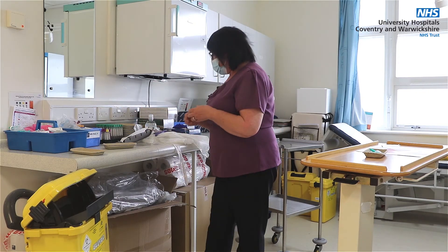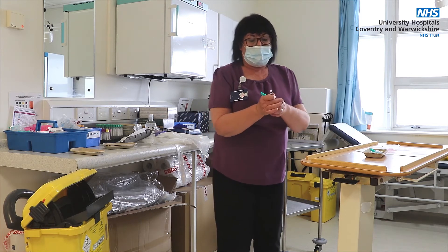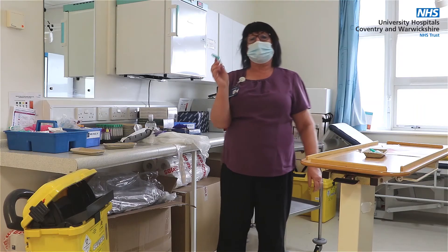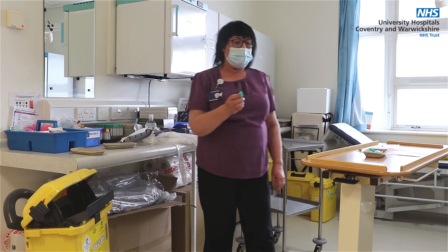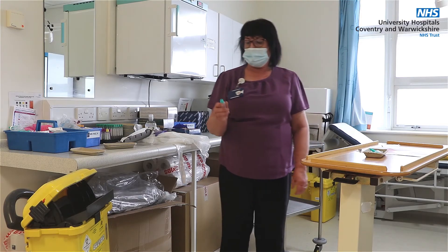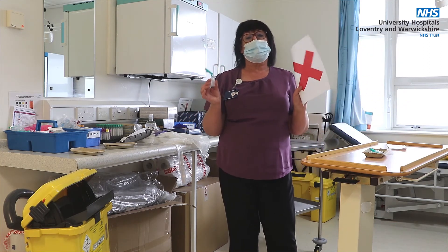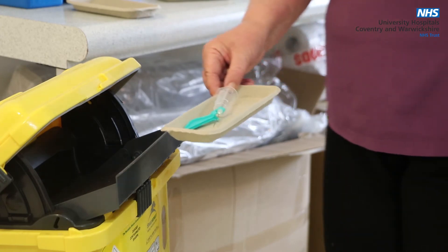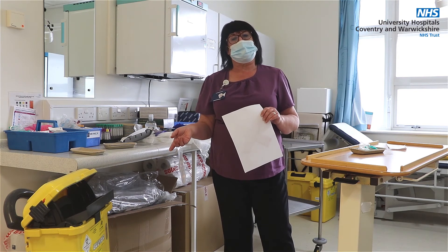Once you've undertaken the procedure — in this case we're using the vacutainer and the needle — I'll open the needle to show you. Please make sure that you know how to use the particular equipment you are using. For phlebotomy, you just put the safety device on a hard surface and push it over. Please make sure you activate the mechanisms. Do not put your needle onto a tray exposed and then take it to a sharps box, as the majority of needlestick injuries occur when disposing of sharps.